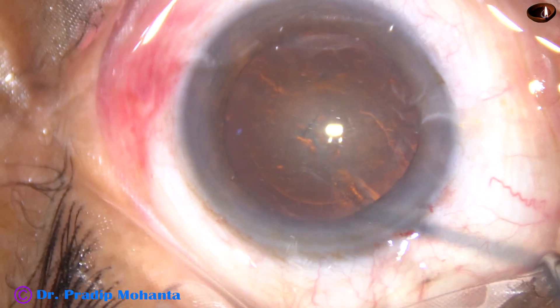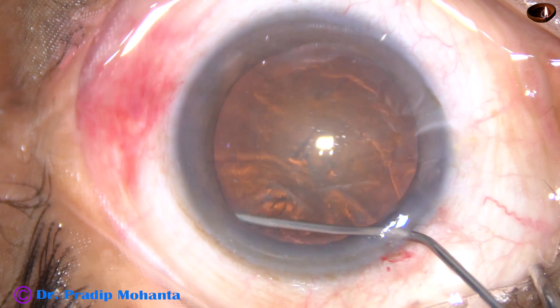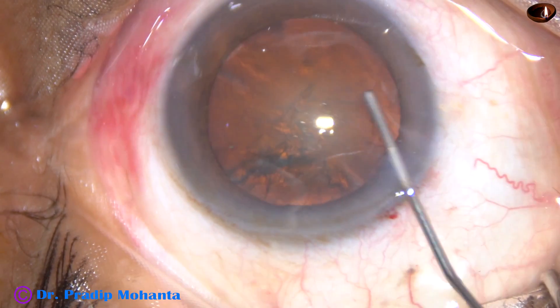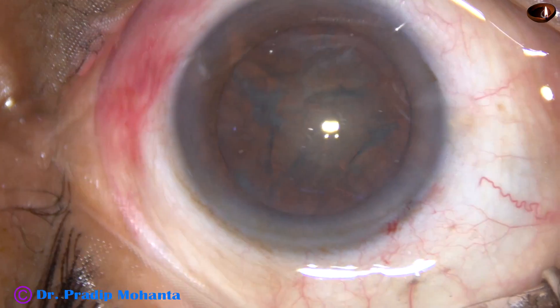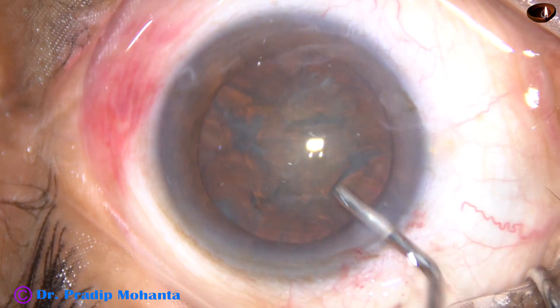Hydrodissection is being done with the help of BSS and a 27-gauge cannula. The nucleus is balloted — the fluid comes anteriorly along the equator and the lens mass gets separated from its capsule.